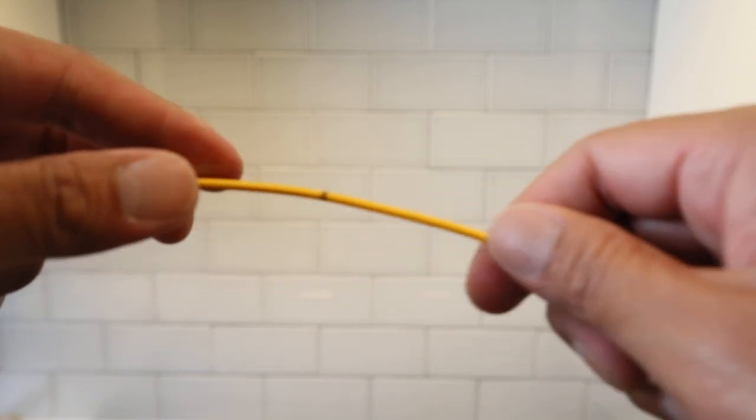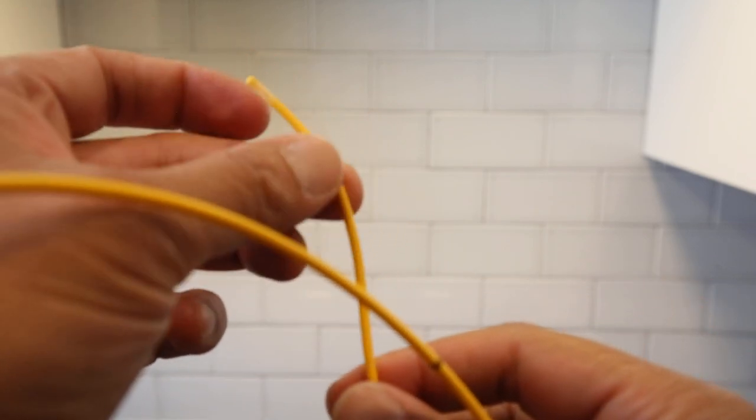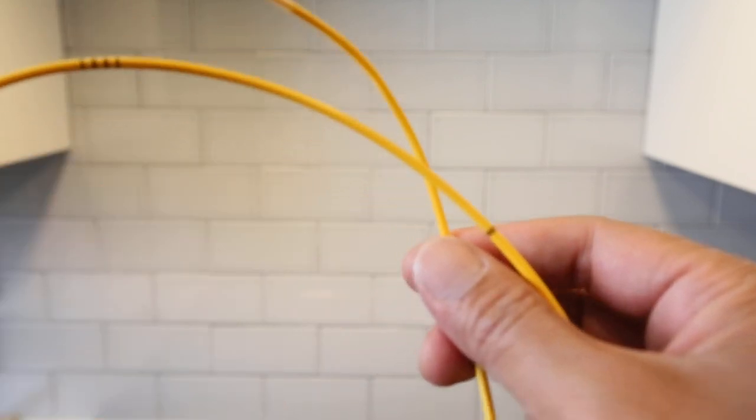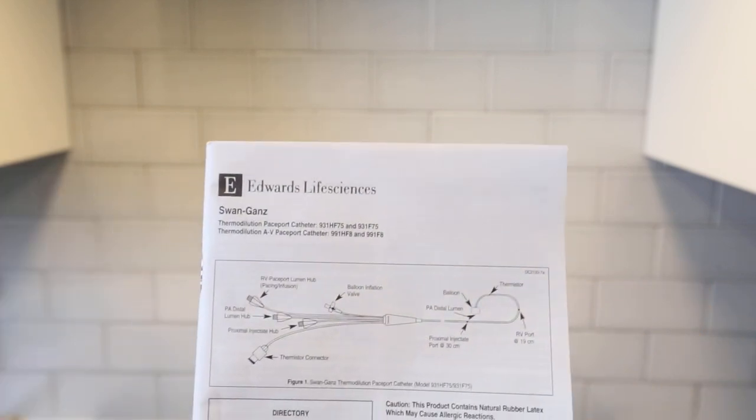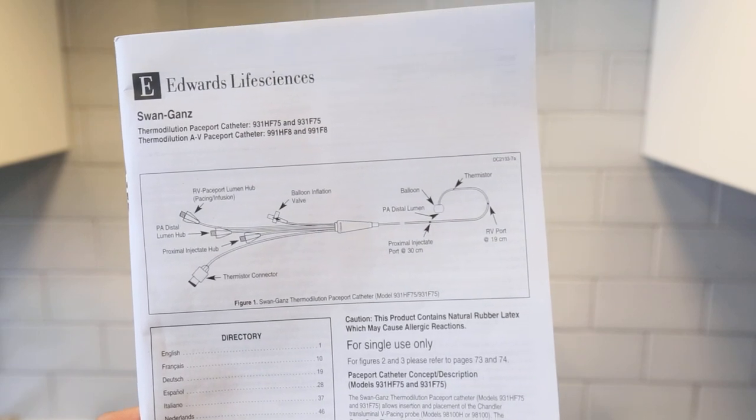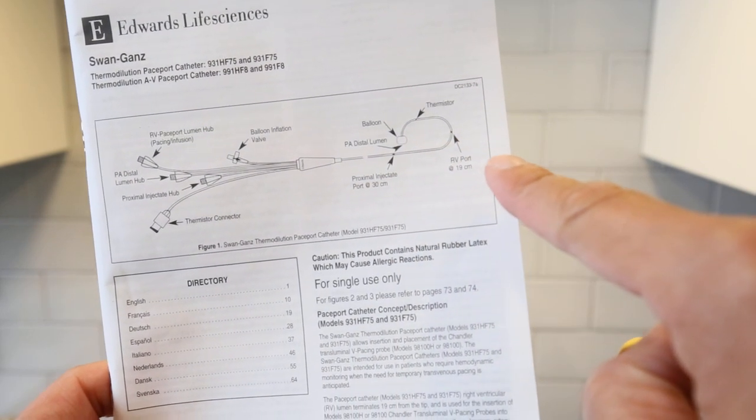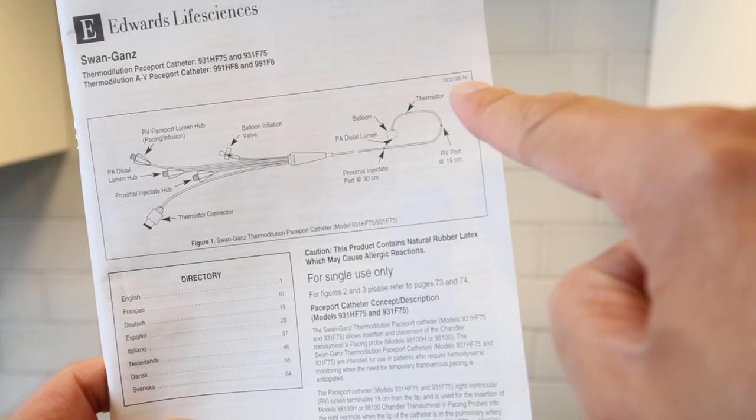So from the balloon, you have your, let me see right there. So this is your RV port and then thermodilution, proximal.